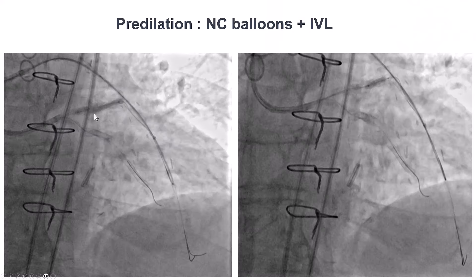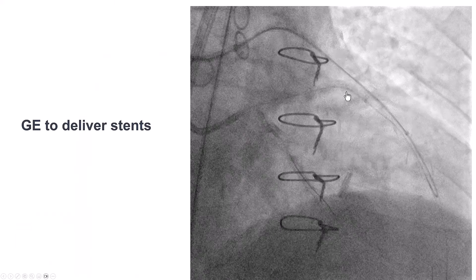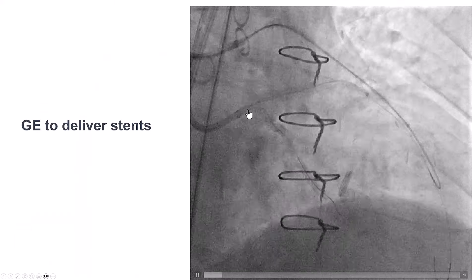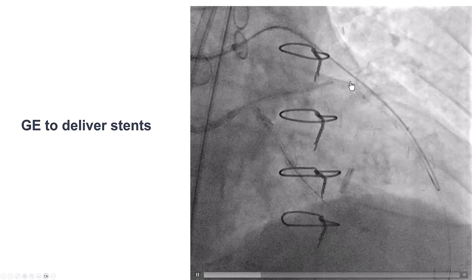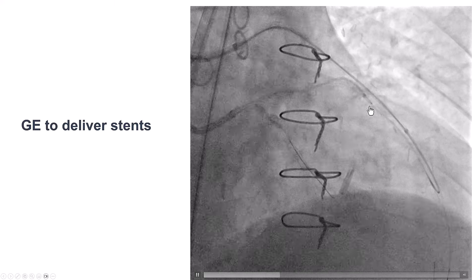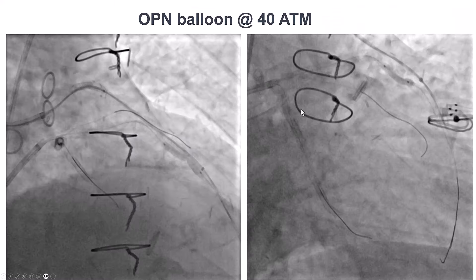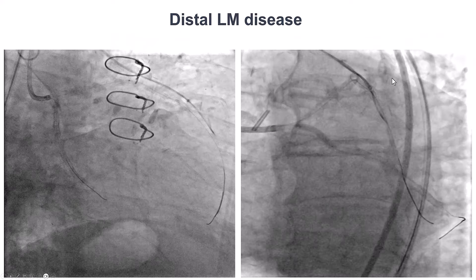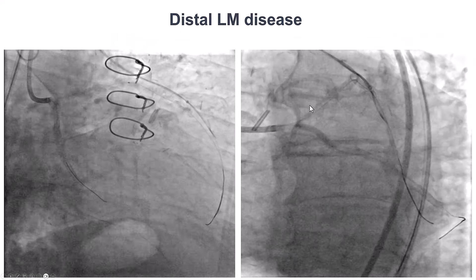We predilated, but there was significant calcium and balloon under-expansion, so we performed intravascular lithotripsy. We then used the antegrade guide extension to deliver long stents. There was still an area of under-expansion, so we used the SIS open balloon up to 40 atmospheres, which successfully expanded this area of calcification.